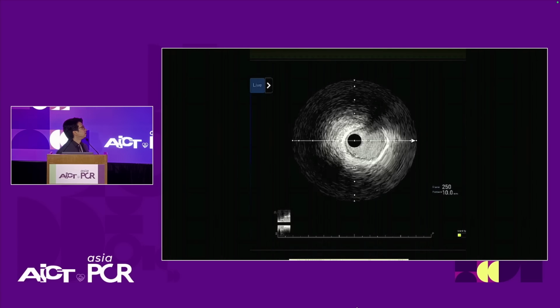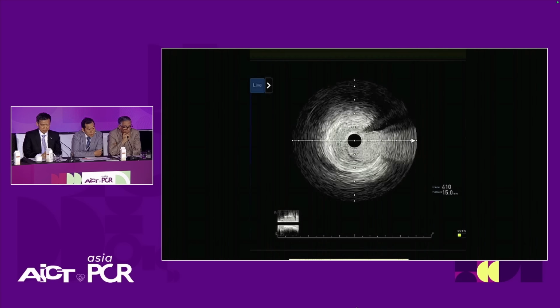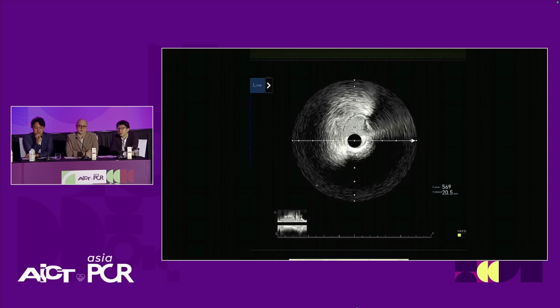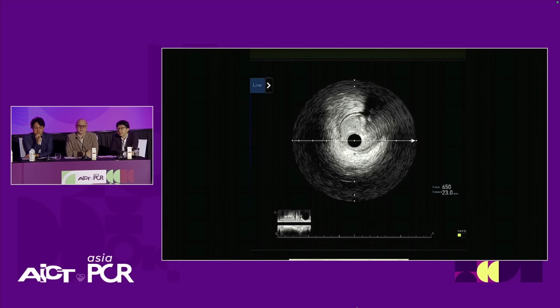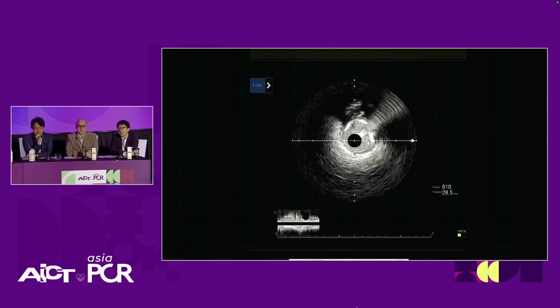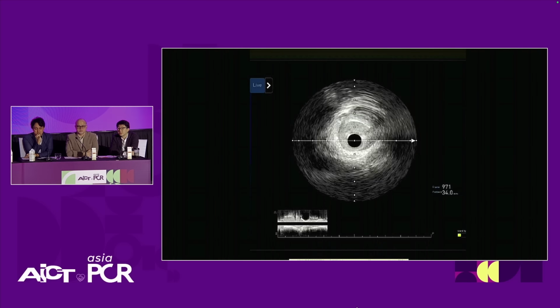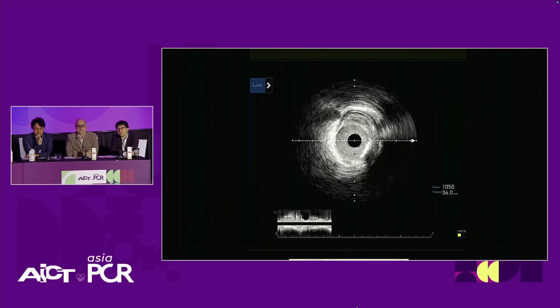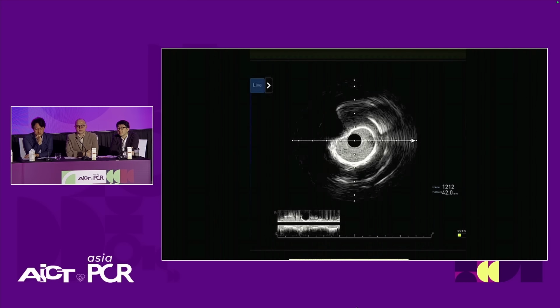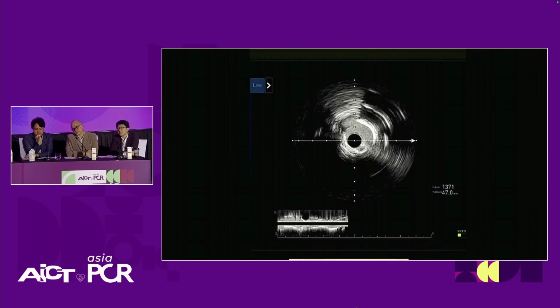Thank you. So far, looking pretty nice distally. And we're starting to see maybe a little bit of perivascular hematoma, and you can see some calcium modification, especially where the wire bias was. You see a luminal gain, as well as some concavity from the rota burr, probably. Over here, the wire bias is not so favorable as eccentric calcium, so not much modification over here. There are some reverb artifacts here, probably some modification done over here, so that's good. Not so much heavy disruption of the calcium over there.